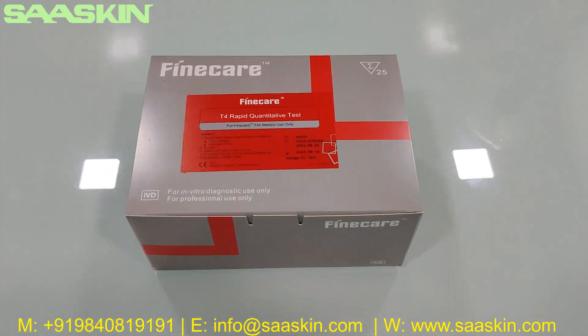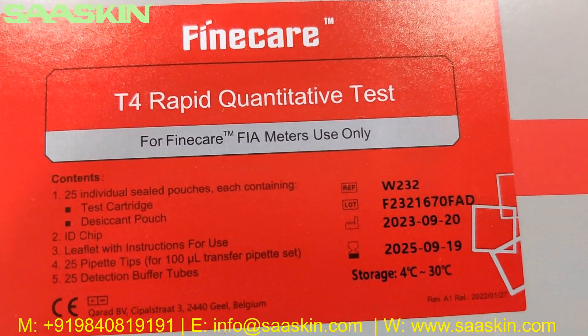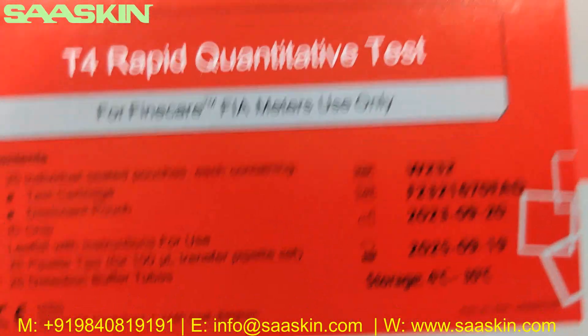Hello everybody, today we are going to see the unboxing of Wondfo Finecare T4 Rapid Quantitative Test. It says Finecare T4 Rapid Quantitative Test, to be used in the Finecare FIA Meters only.